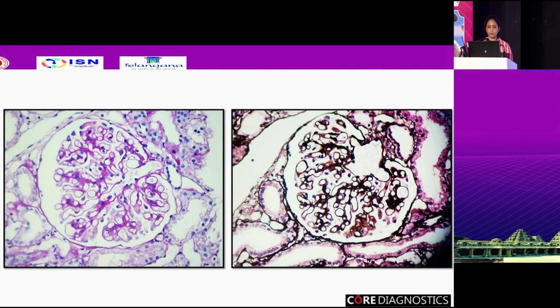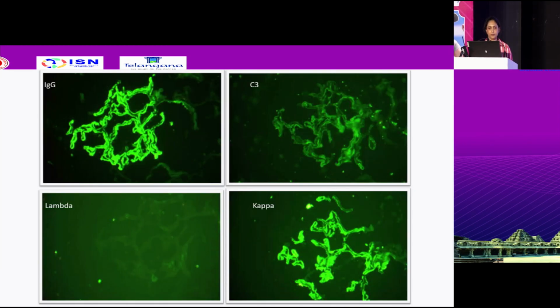The light microscopic evaluation revealed diffuse uniform thickening of the basement membranes, which showed subepithelial spikes and pinholes on the silver stain. So here itself, it was a clear case of membranous nephropathy even without going ahead with the IF. Now moving on to the IF evaluation. The IgG showed diffuse peripheral fine granular deposits, which were quite significant. I would give it a scoring of 3+ to 4+. There were minimal deposits of C3. There were no deposits of IgA, IgM or C1q.